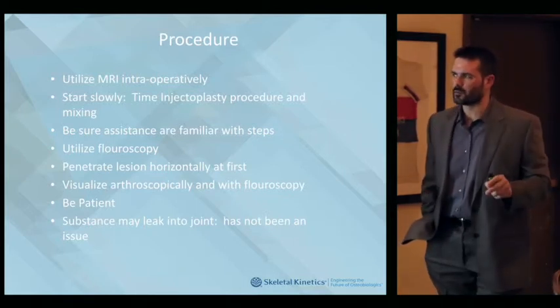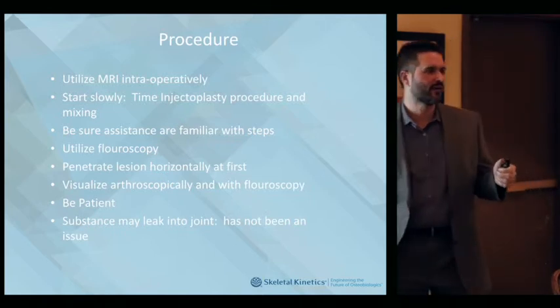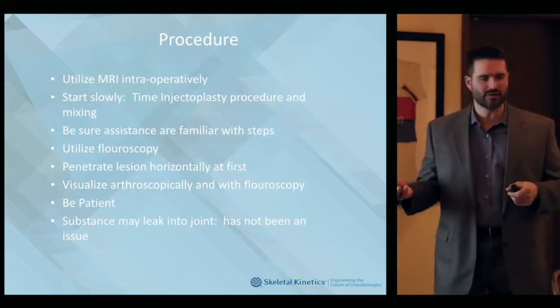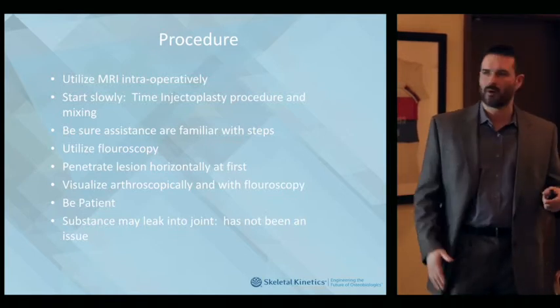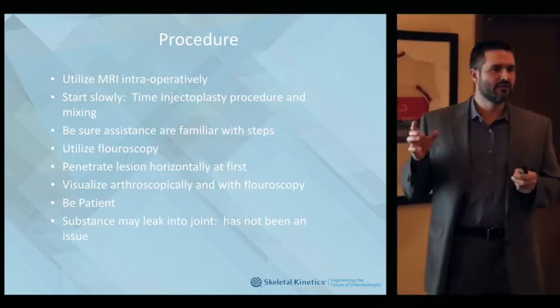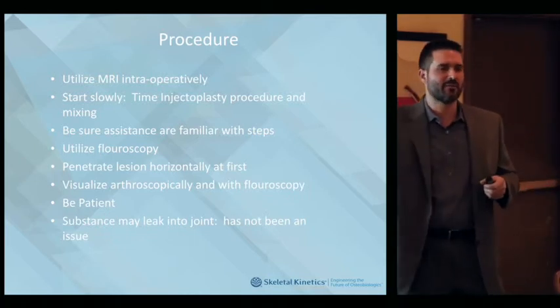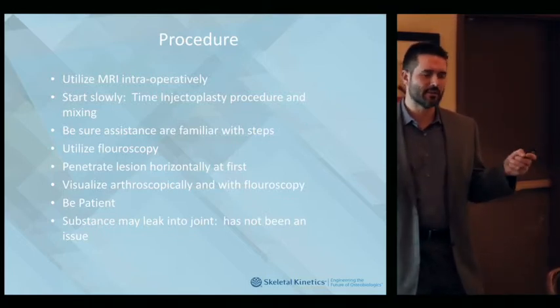So from the procedure standpoint, I think it's really important to have your MRI, know your MRI, have it available in the OR, whether it's on your computer or you can get it from the hospital. I have all my stuff on my flash drive. At my office before my surgeries, 2 days before they put them on my flash drive. Start slowly, meaning you got to make sure you're set. You don't want the stuff to be hardening before you have time to get it going. So make sure the person on the back table knows what they're doing. And, your reps or whoever. It's pretty simple. It really is.